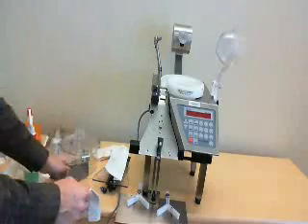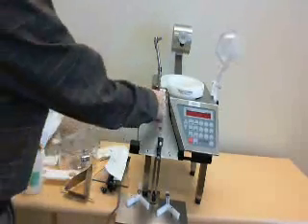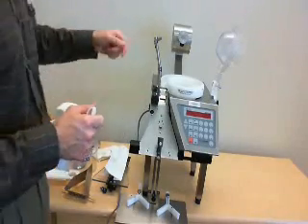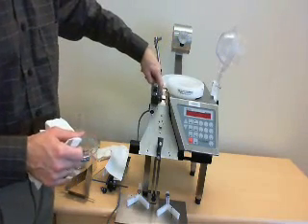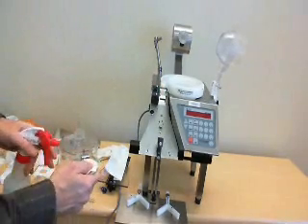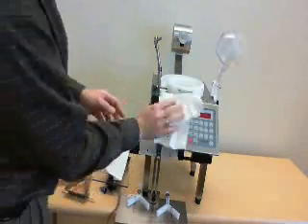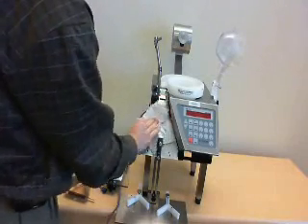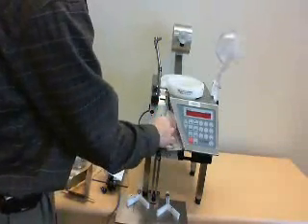We've now exposed the electronic sensing system, the optic sensor right here. This is important to keep clean. You may even find during runs of particularly dusty medications that canned air can sometimes just ensure that there's not an excess of dust buildup while this is counting. But if you do discover that your counting errors are occurring with excessively dusty medications, it's likely that this needs a quick clean. Cleaning solution, just ensure that that's clean. One rule of thumb is to clean it as you would your eyeglasses. Firmly, but not too strongly.